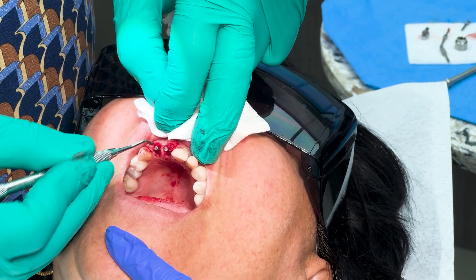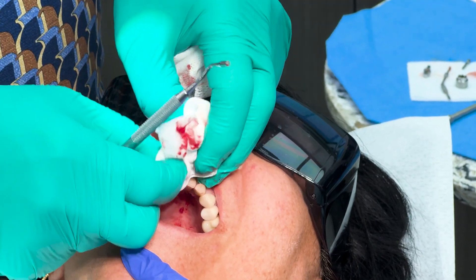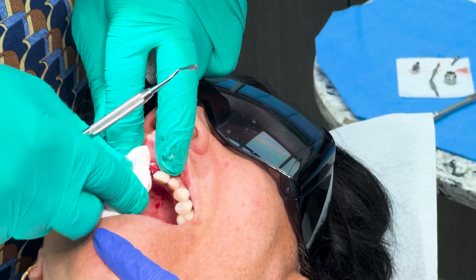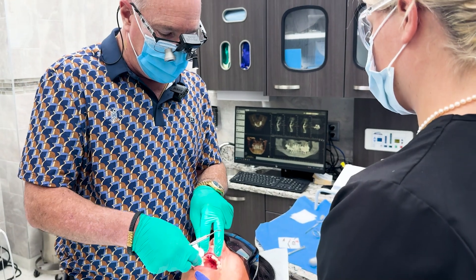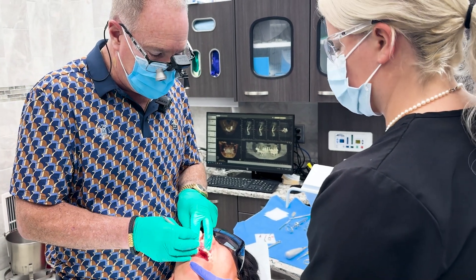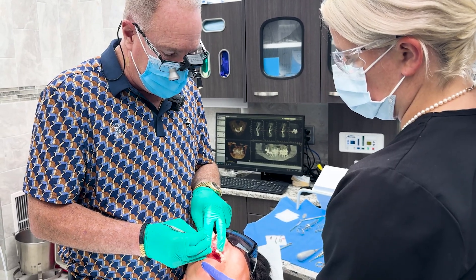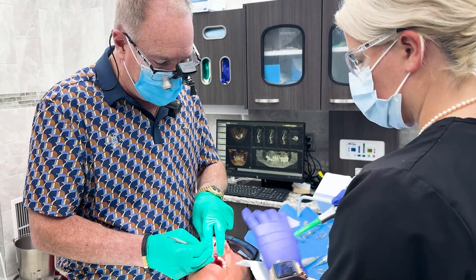Looks good. I'm going to leave it to my very capable assistant Dominique to help make some nice looking temporaries for her. We'll keep them out of occlusion and make them look as nice as we can so she has some teeth to smile with. Even though Halloween's coming up, we don't want to leave her with any metal peg sticking out of her mouth.